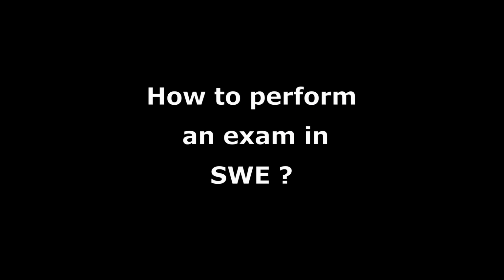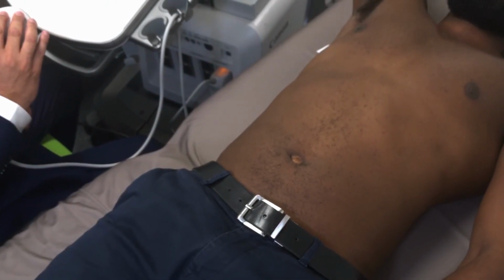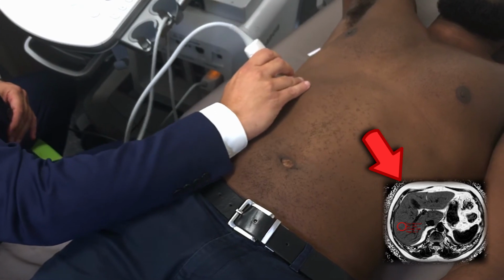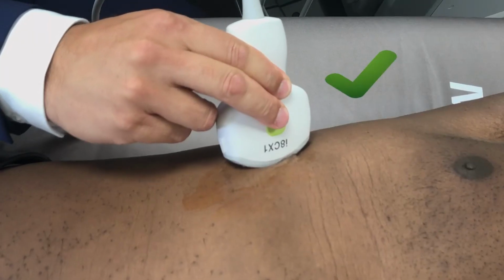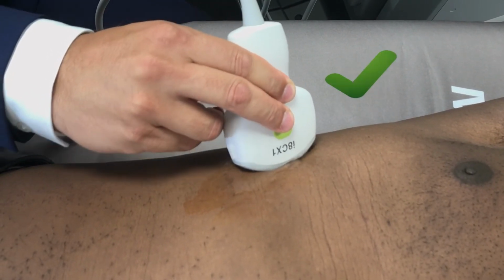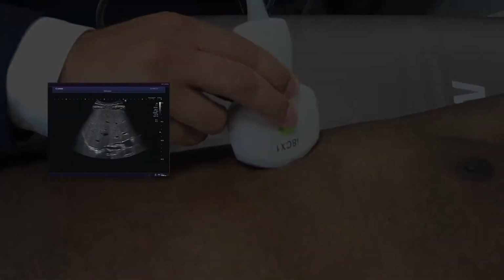How to perform a quick, reliable and reproducible exam? You have to follow some easy rules. Patient fasting at least 4 hours. Patient supine position, intercostal approach and measurement in segment 7 or 8. Probe must be perpendicular to the skin surface and the liver capsule as horizontal as possible in order to get the best ultrasound beam transmission and like this the best shear wave quality.